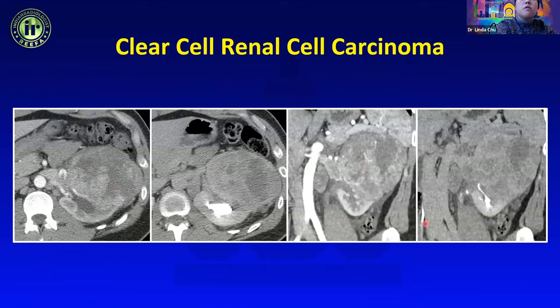Sometimes you just have to accept that you'll be wrong. In this example, a soft tissue attenuation mass that enhances would lead most of us to call it renal cell carcinoma, but it turned out to be fat-poor AML. Similarly, another soft tissue attenuation mass with no discernible fat and internal enhancement was again called likely RCC but proved to be fat-poor AML.